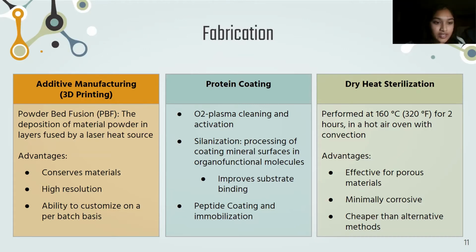The advantages of this over other types of additive manufacturing or even other types of 3D printing are that it will allow us to conserve material, print at higher resolutions, and allow us to customize the screws per batch.